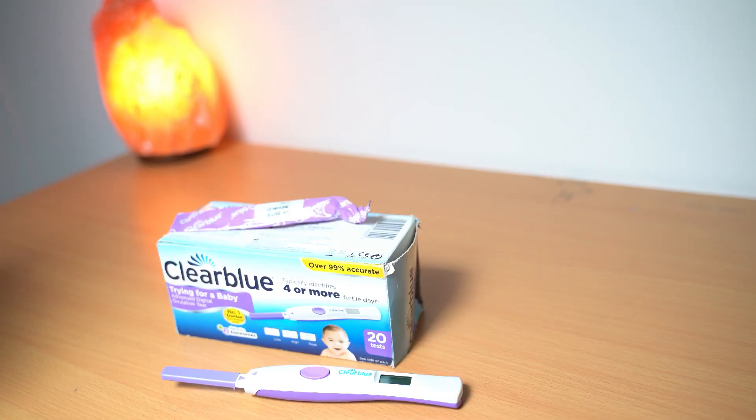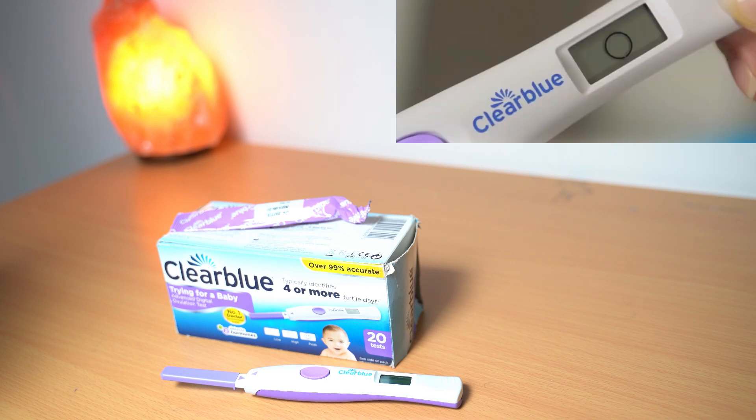Don't forget there are three results that you're going to be expecting from this test. As it's blinking, that tells you it is trying to read the results, so it takes about five minutes to get the result. It's going to give you three types of results: either the circle, which means no ovulation.